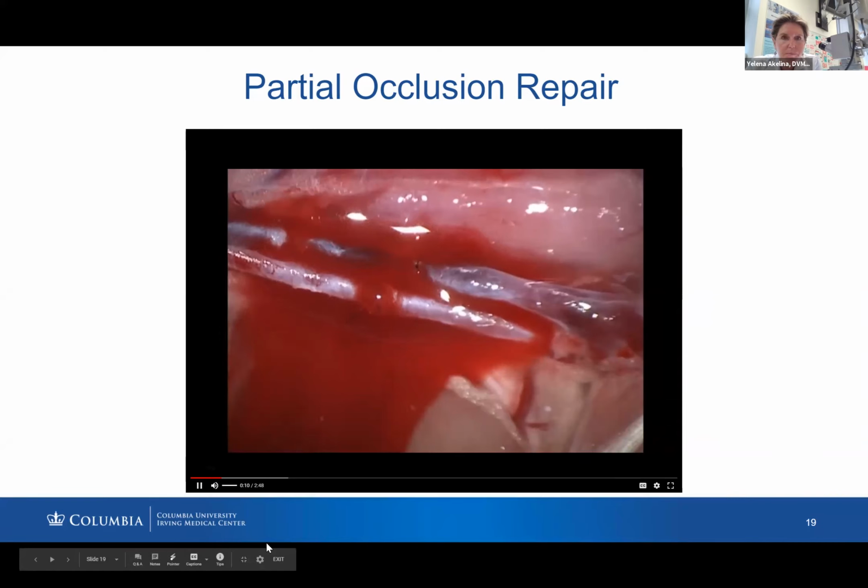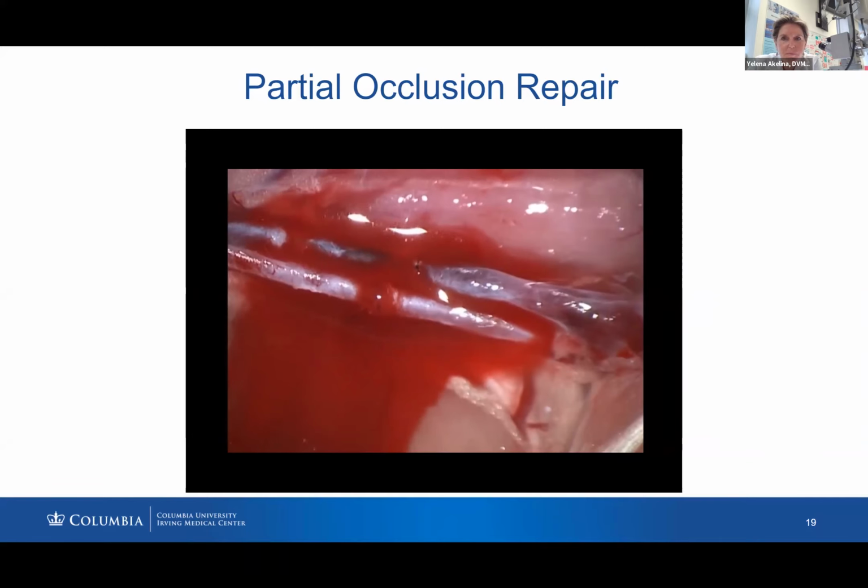Imagine this scenario. You've just finished your anastomosis when you come across this disaster. Your artery is leaking everywhere because your suture placement is uneven. We told you not to drink that extra cup of coffee this morning.